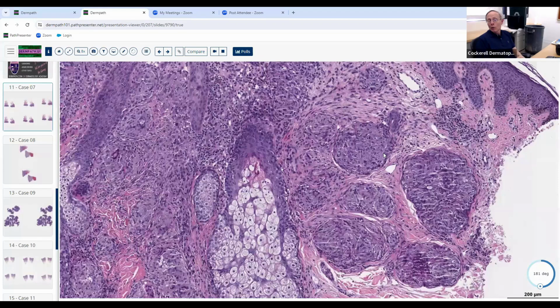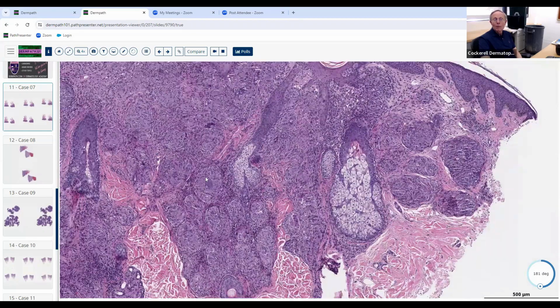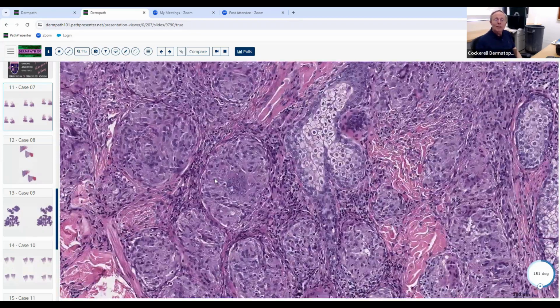They might put tuberculoid leprosy down. Does that give you this pattern? And the answer is yes, it does. And that's often confusing to residents. They say, well, tuberculoid, you think about a tuberculoid granulomatous histology with caseation degeneration, looks like tuberculosis. Well, no, it doesn't. It gives you a sarcoidal granulomatous dermatitis pattern, because basically the opposite of the other granulomatous pattern you see in Hansen's disease is not sarcoidal.